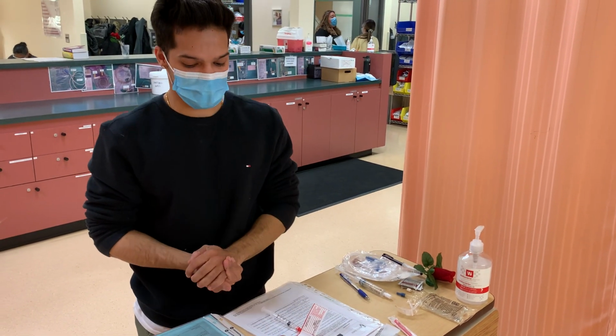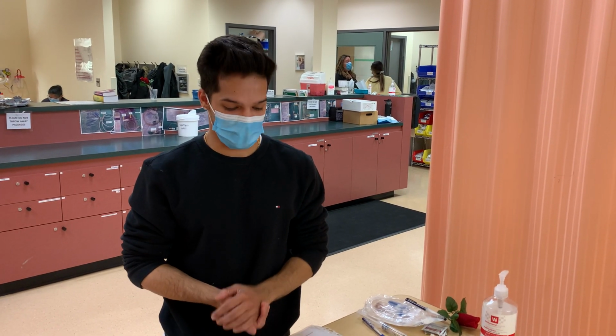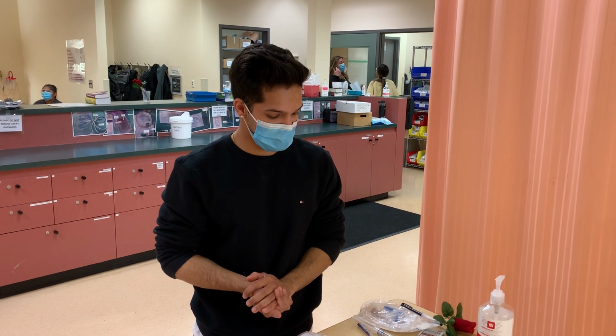Okay, so now that I've done my second check by myself, I'm going to be asking a buddy nurse to come and do an independent second check. And then once she's clarified that everything is good, they've done their independent second check, everything is good, I'm ready to mix my medication within my bag.